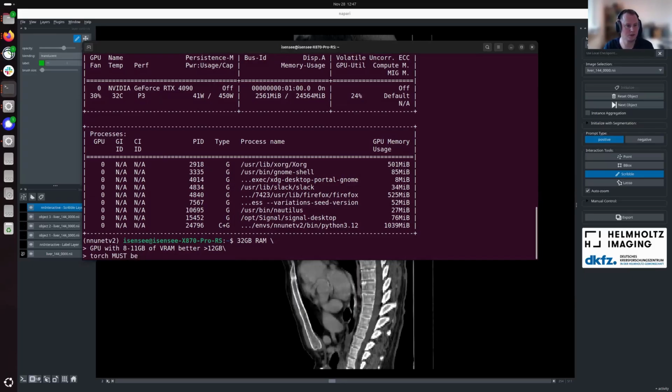Since we had this issue again this morning in an internal meeting, there is a problem with Torch 2.9.0, and it's imperative that you install something smaller than that. Okay. Because there was a cuDNN bug which caused the Torch developers to disable cuDNN paths, which causes performance and VRAM issues. So make sure you're installing Torch 2.8 something or previous versions and not 2.9.